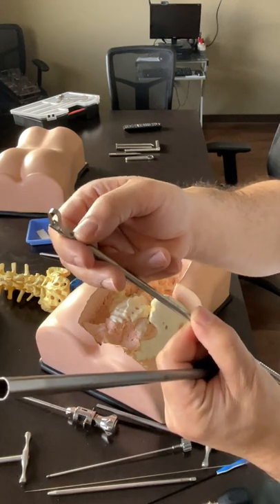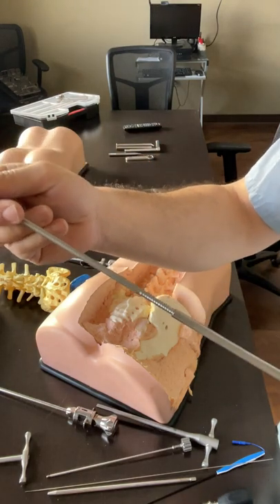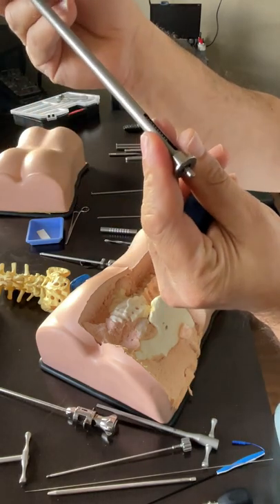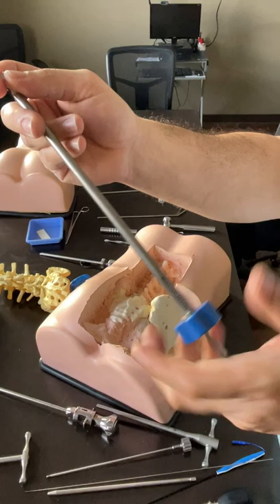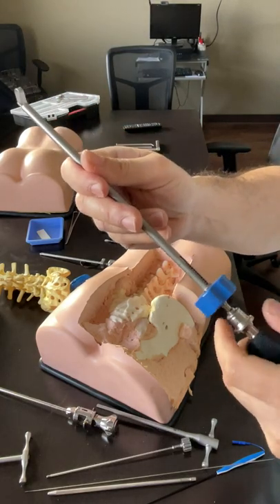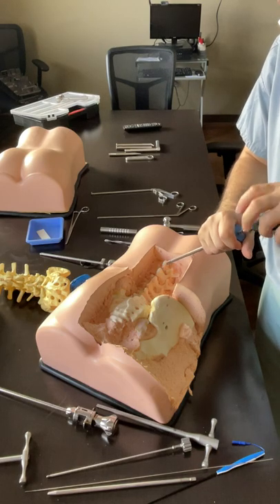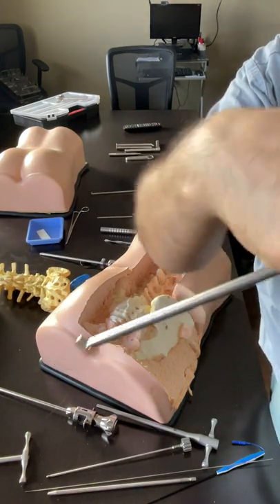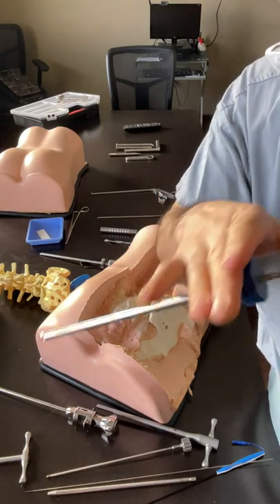One hundred percent of the time when it has happened, it breaks there. Sometimes I even aim for that because then I know I have used the maximum capacity of this. The groove goes in the direction of the window. Before it comes out, you have to put this in and then turn. At that point you can attach the grip, which helps you pull it in better. When you are in, do not turn the outer handle, because if you turn it, the tip just turns around. You have to hold the outer part steady and turn only the knob. If it blocks, just keep it open and use the other three.